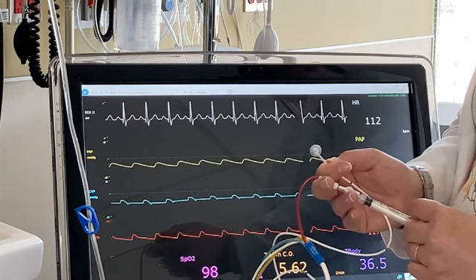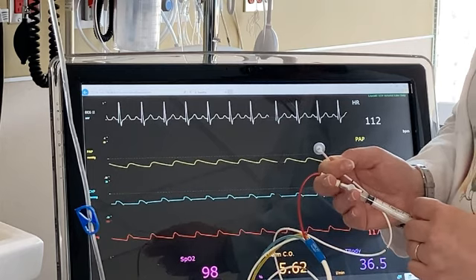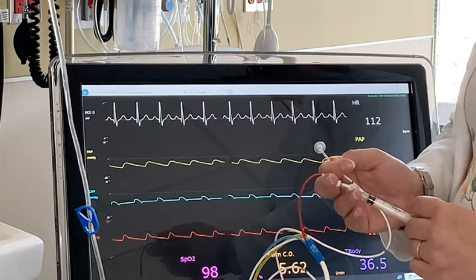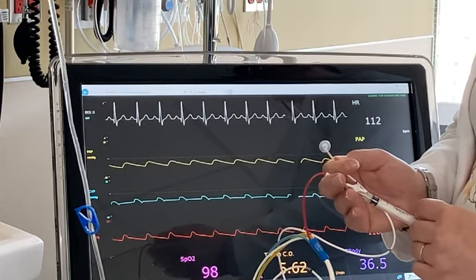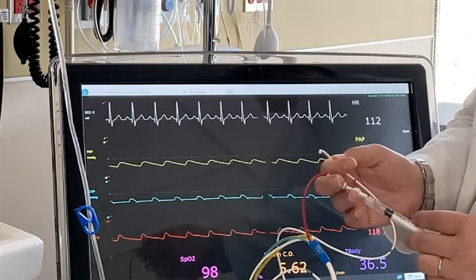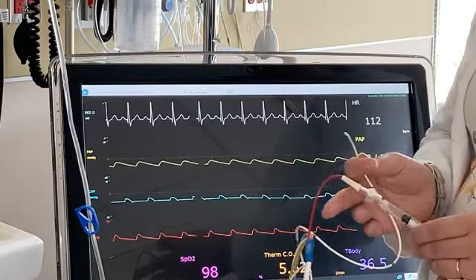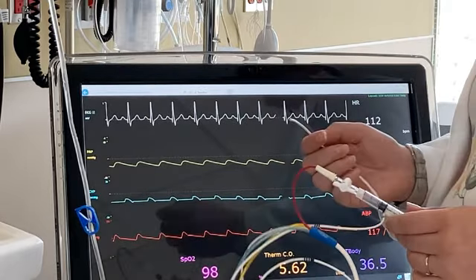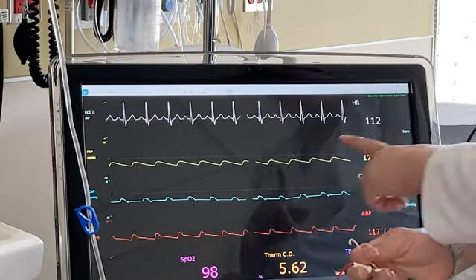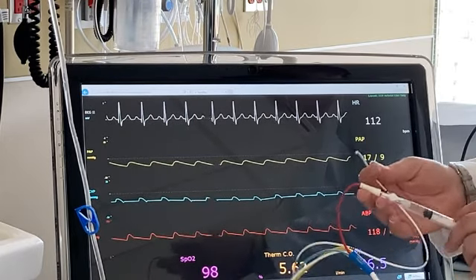So just to keep that in mind, if this were to stay inflated, this would definitely cause necrosis of the pulmonary artery, and the pulmonary artery would essentially tear apart, and your patient would be in much trouble. So what we do with our patients when we are measuring our cardiac output, cardiac index, CVP, pulmonary artery pressure, and our pulmonary artery obstructive pressure, or occlusion pressure, I would go and look at my yellow line here, my waveform for my pulmonary artery pressure.